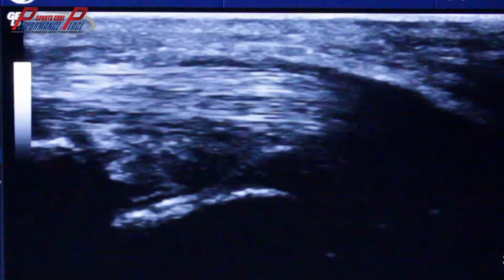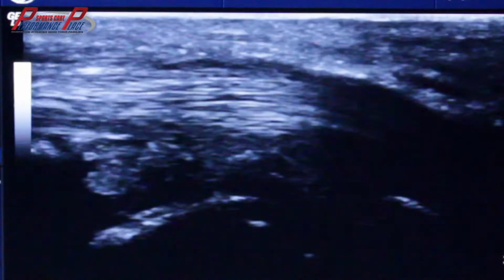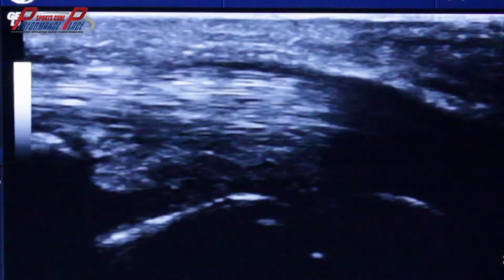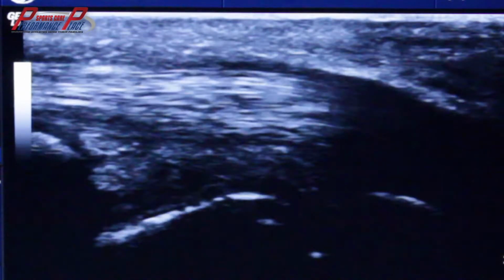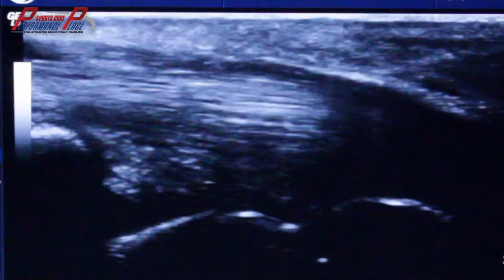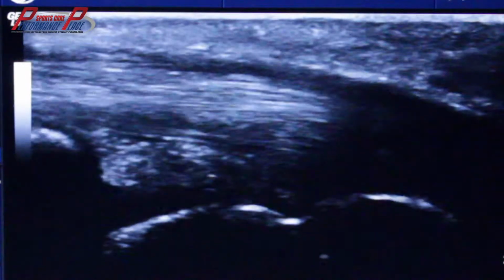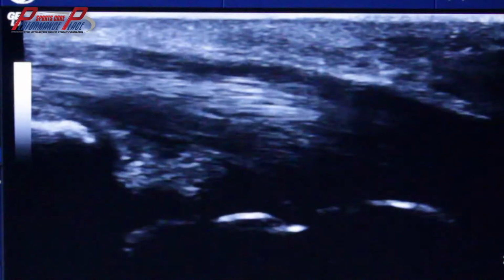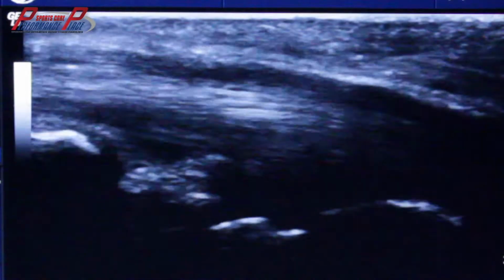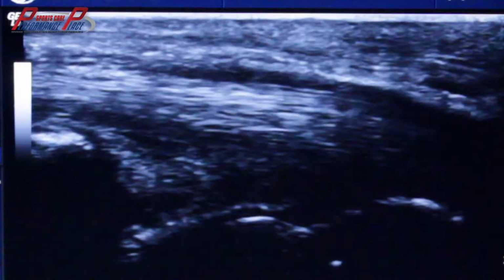So in this picture right here, I'm actually not going to move my wrist at all. My fingers are completely extended, more in the anatomical position. We're going to keep our eye on the area of black right above it. I'm tilting my head to the right, away. Sorry, let me position again. Might have some artifact in here. Okay, so this is probably the best I'm going to get in this video.